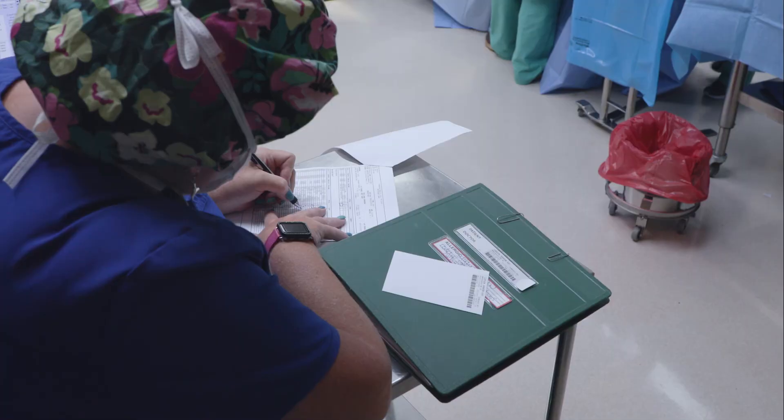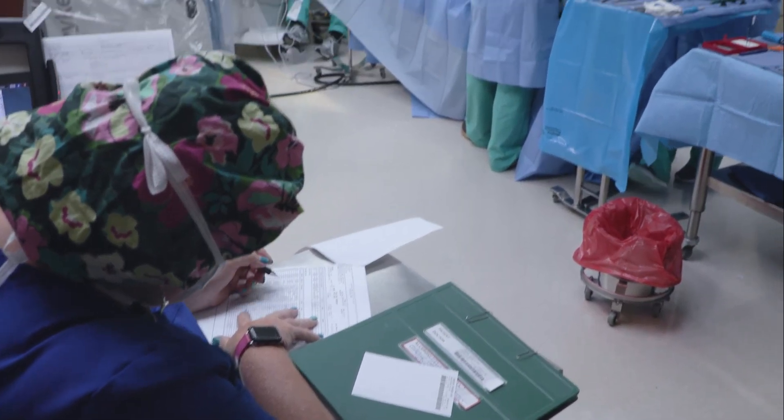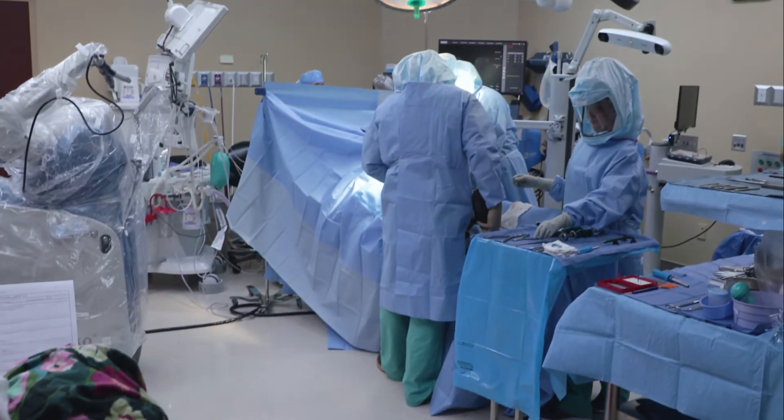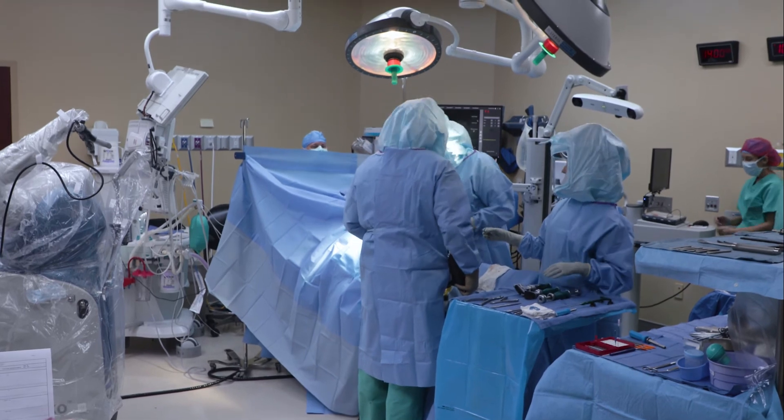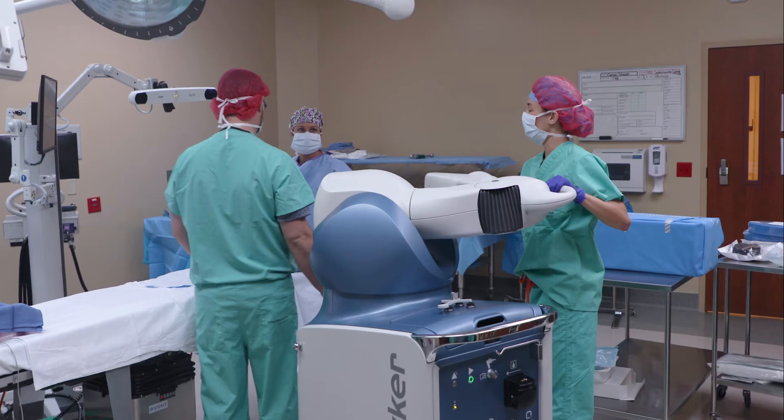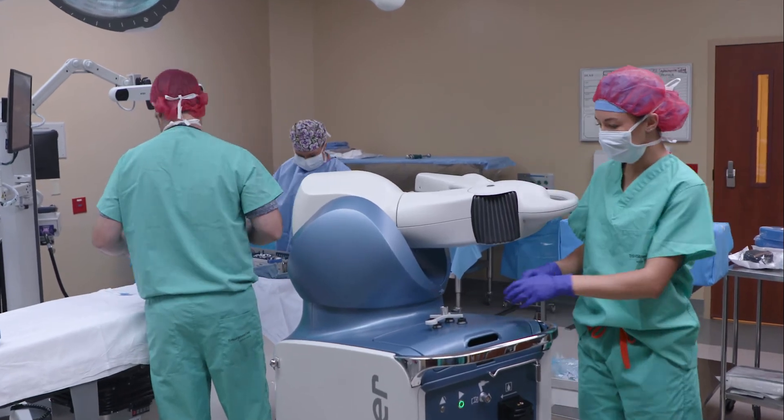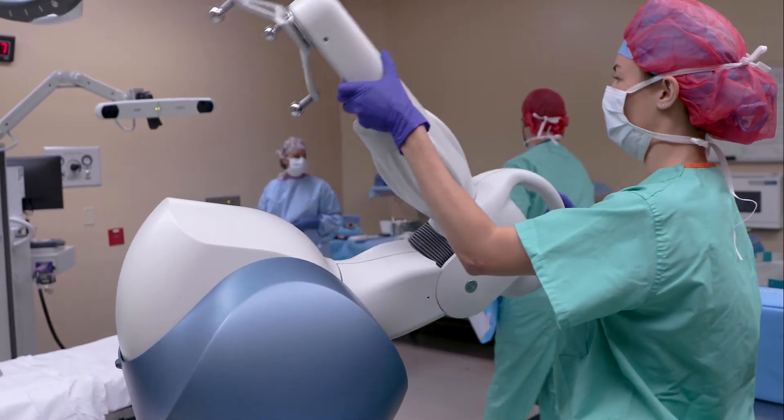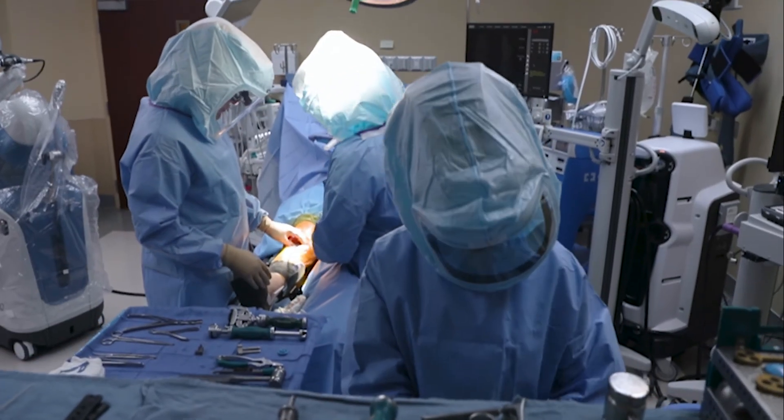The data shows that patients have less pain, it restores mobility a little quicker, and patients recover much more quickly. I tell patients you might as well take advantage of the absolute best technology out there. I think all the things that surround the system have shown that it's soon to be the wave of the future.